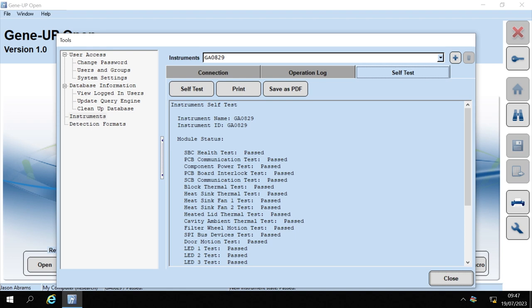The self-test must be run at least once per day prior to your first sample run, or when the GeneUp thermal cycler is powered on. Once the self-test completes, the results will display in the self-test message box. If a self-test fails, the report will indicate fail and/or the instrument's LED will flash blue and red.